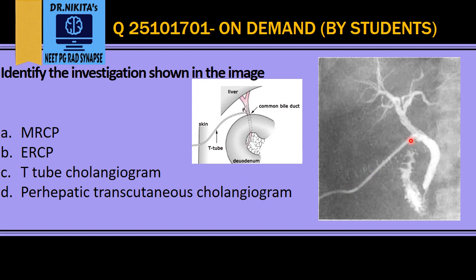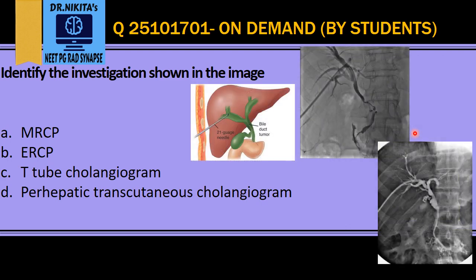Next, this is a T-tube cholangiogram. How do you identify this? You would see a T-tube going from the skin surface towards the CBD, and it has a limb like the letter T — that is why it is called a T-tube — which goes into the CBD. So here we see the T-tube, the limbs of which are going into the CBD. That is a T-tube cholangiogram.